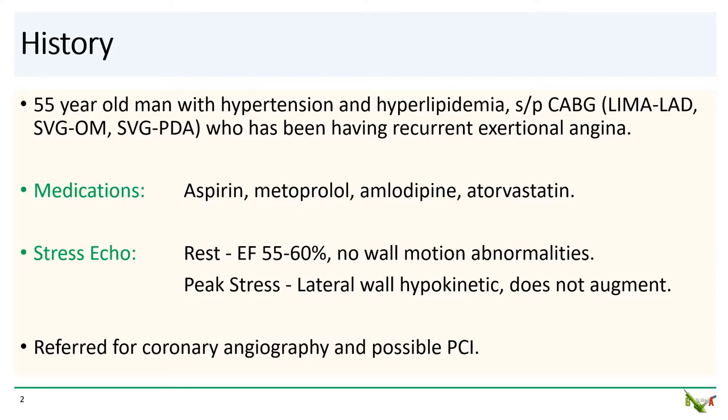The patient is a 55-year-old man with hypertension and hyperlipidemia. He has coronary artery disease and his status was post-CABG. He had a LIMA to the LAD, a vein graft to an OM, and a vein graft to the PDA. He presented to his cardiologist with recurrent angina and is on a reasonable medical regimen. He underwent a stress echo which showed evidence of lateral wall ischemia, and his baseline EF was normal. He was thus referred for coronary angiography and possible PCI.